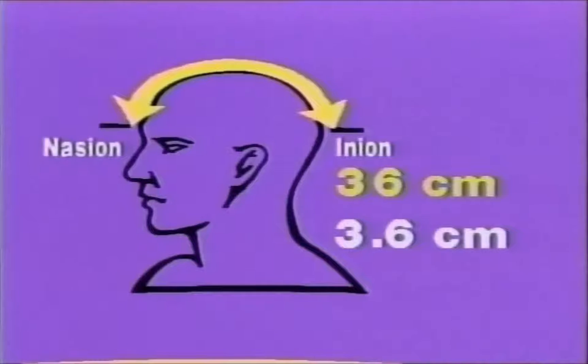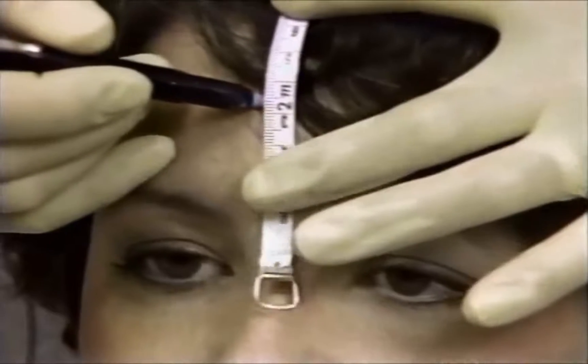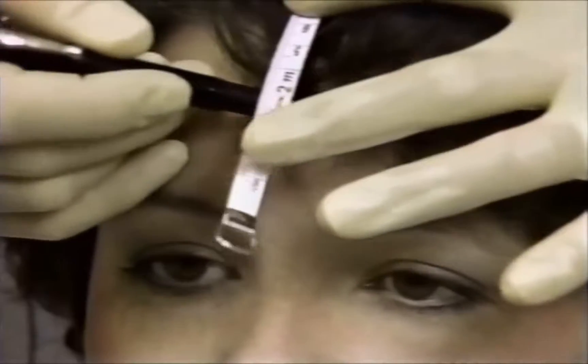For example, 36 centimeters would result in a measurement of 3.6 centimeters. Measure up from the nasion 3.6 centimeters and mark the FP line.